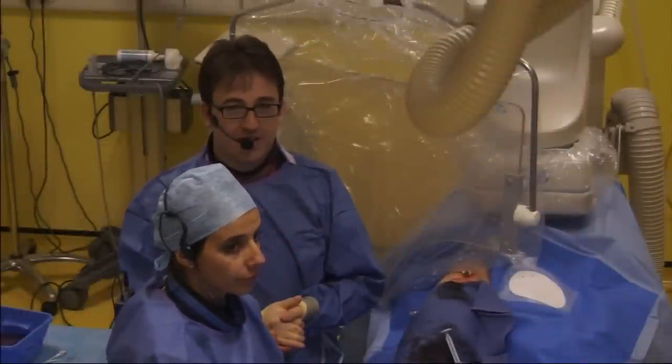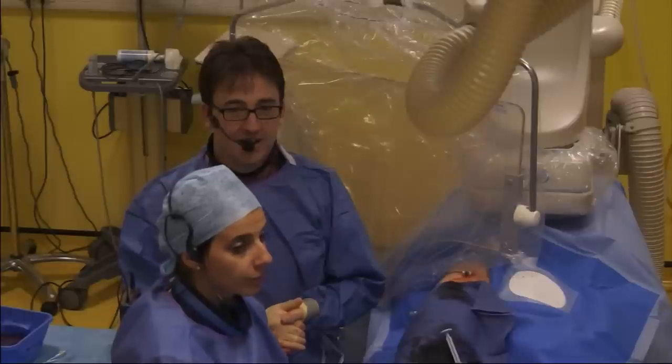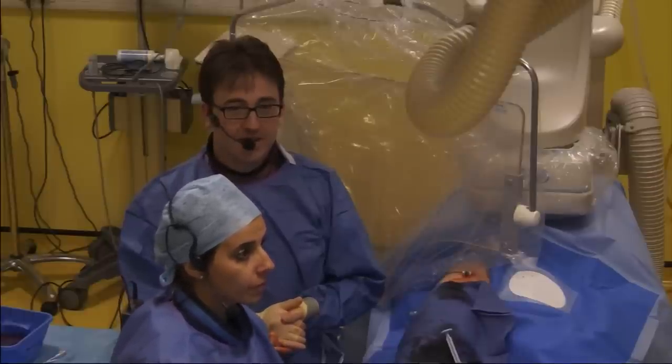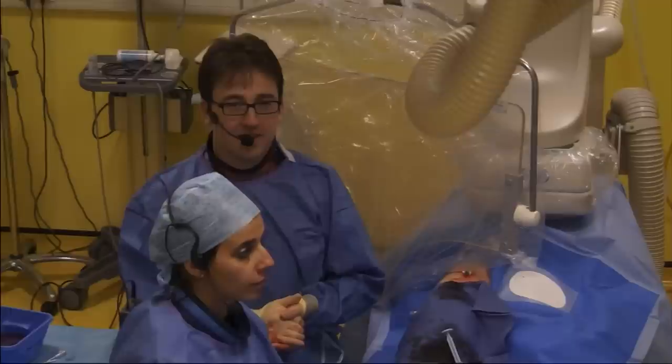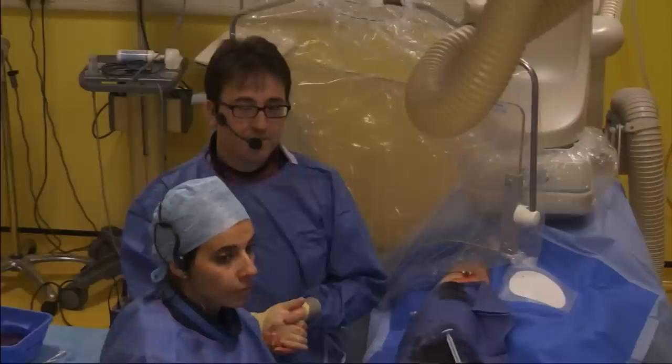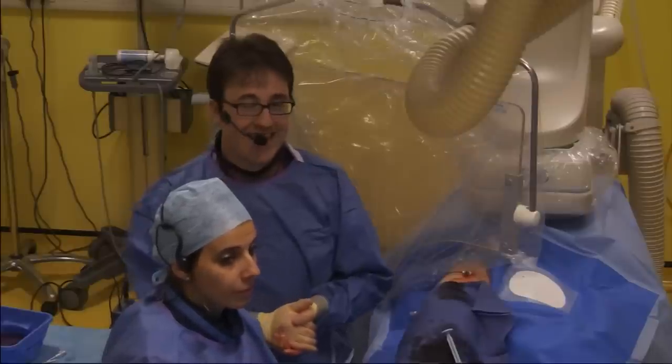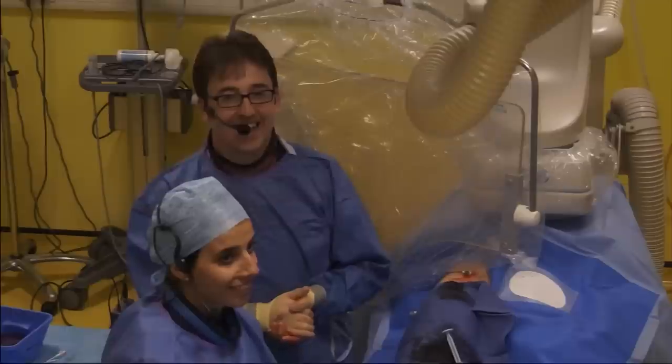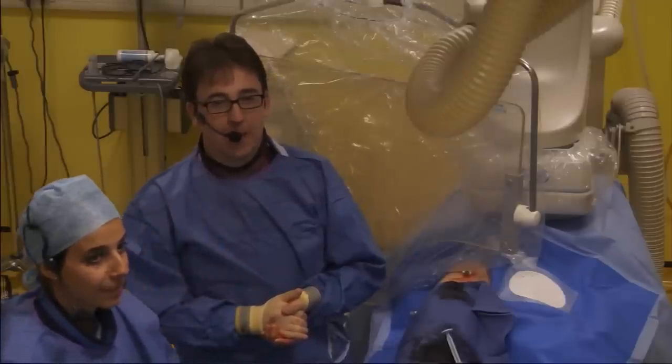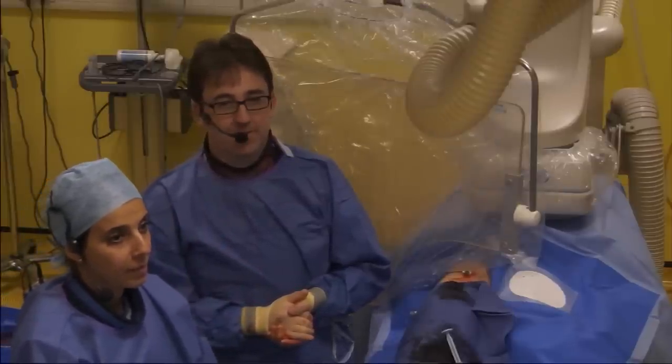I think you have shown beautifully how quick this procedure can become with a spiral catheter. The big advantage this represents also for the patient comfort. It was in a way unexpected that it was so short because we all didn't know enough about these virtues of the spiral Symplicity catheter. So, thank you very much, Justin. Thank you very much.